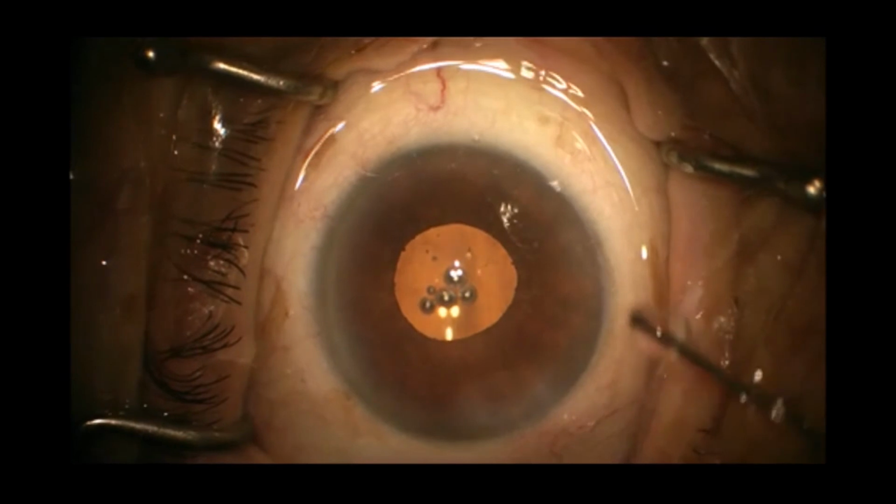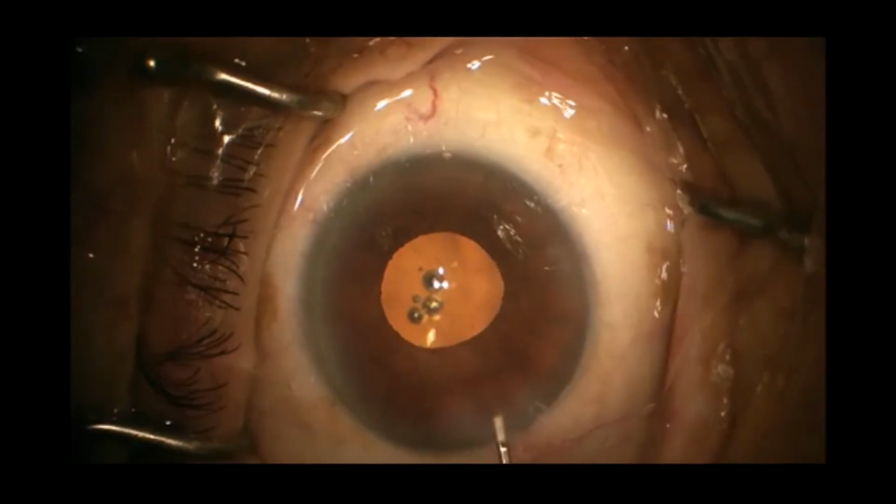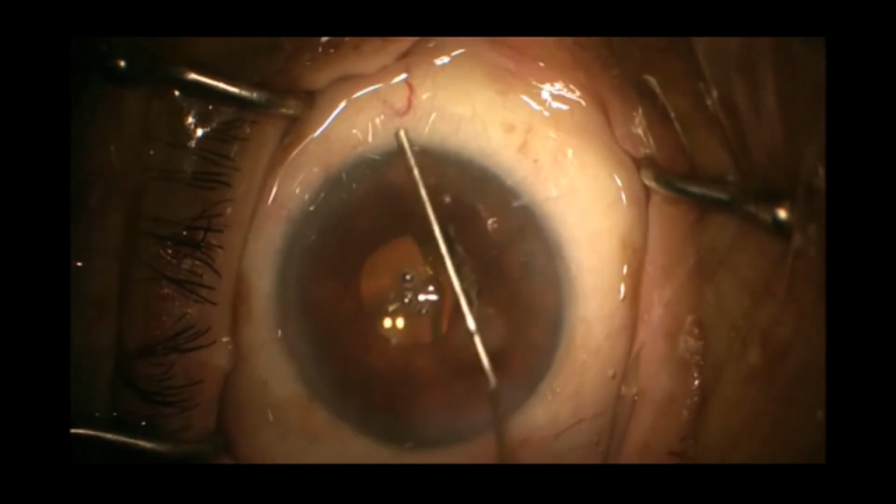Main ports are hydrated, side ports are hydrated, and a watertight chamber is achieved.